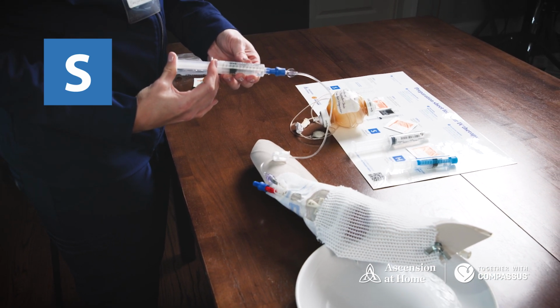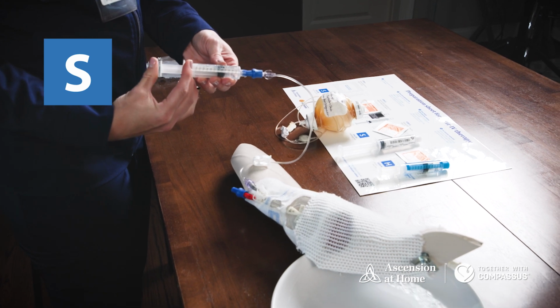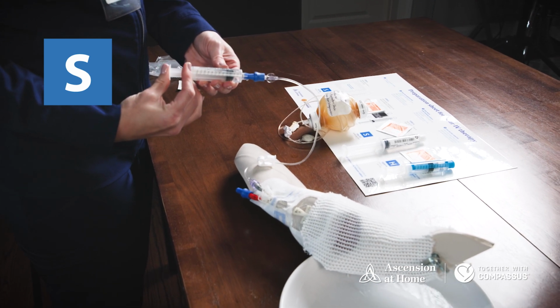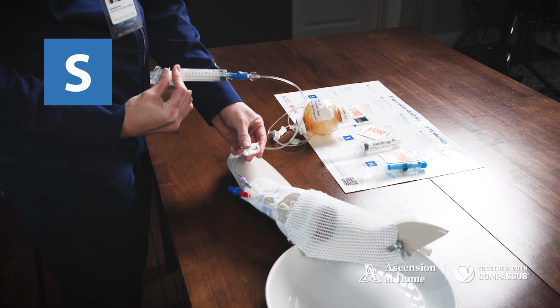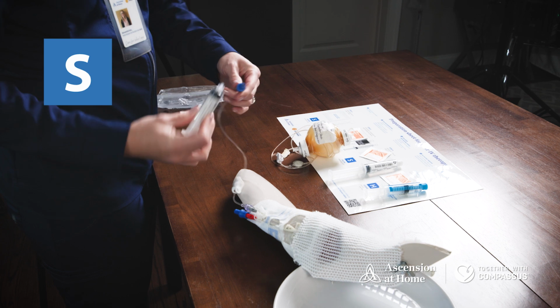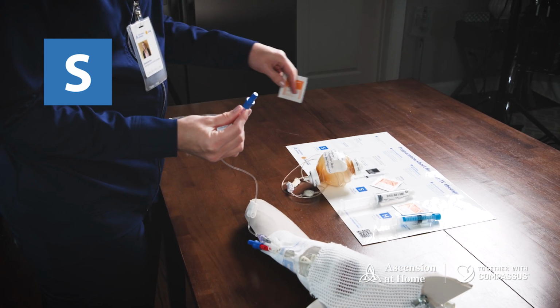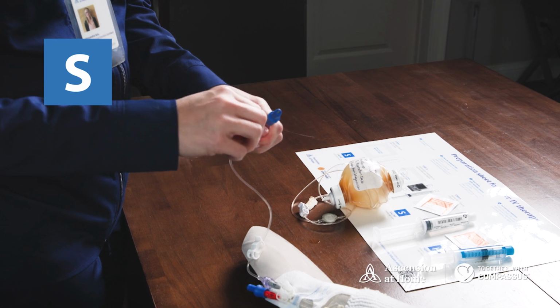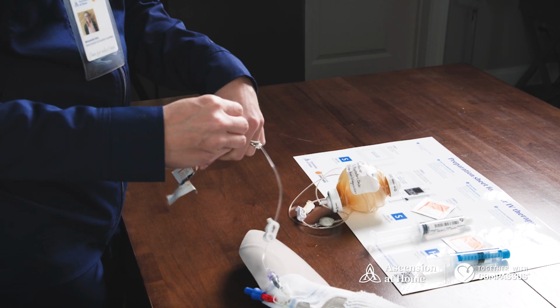If resistance is met, do not try to force it. Double check that all the clamps are open. If the clamps are open, call your nurse or pharmacist for further instruction. When the entire syringe has been administered, clamp the tubing and remove the syringe and discard into the trash. Be mindful not to touch the clave. Pick up the next alcohol wipe and scrub the clave for 15 to 30 seconds and allow it to air dry.